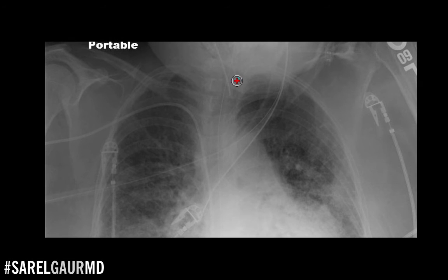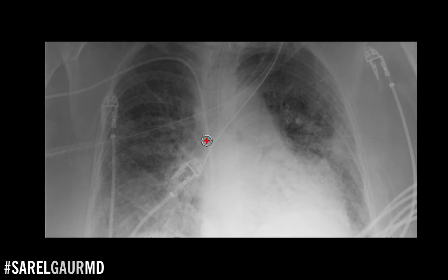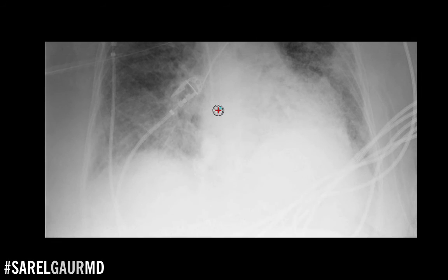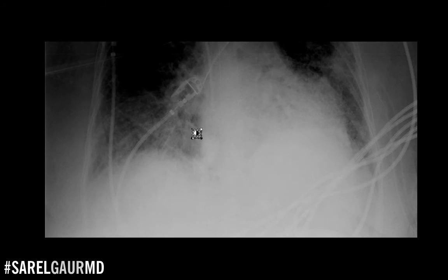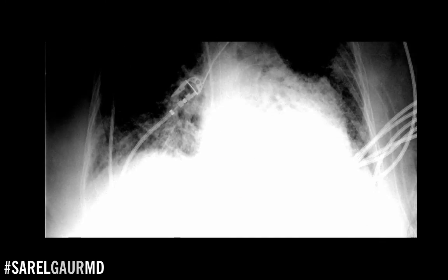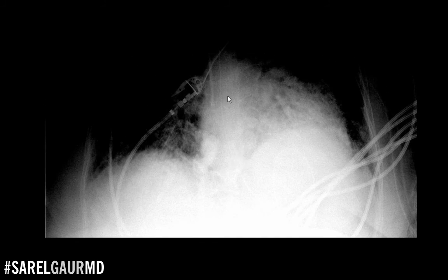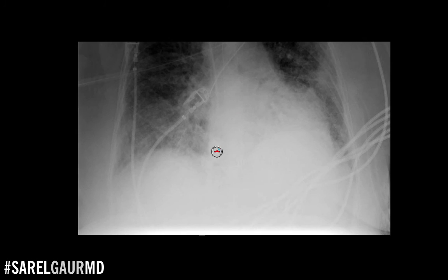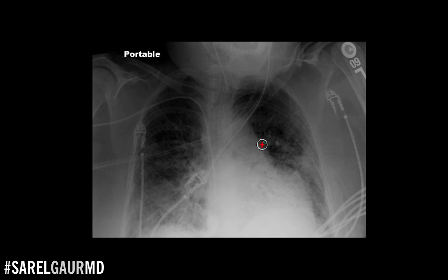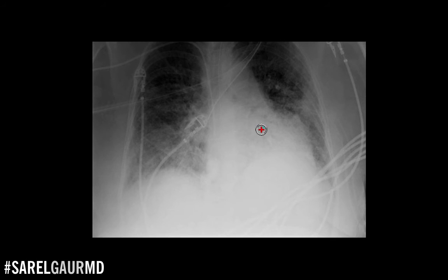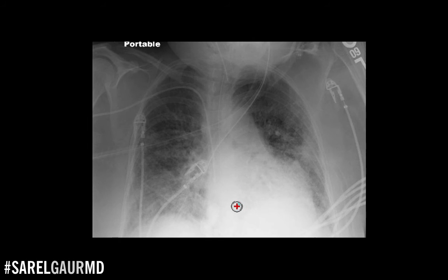Assuming I did that, looking at other lines and tubes: I'm seeing this nice PICC line here, tip in the lower SVC — good position. I'm seeing this enteric catheter coursing down in the midline, and tracking it further down, it's coiled under the left hemi-diaphragm, so definitely within the stomach and in good position. There's also some tubing that's external and telemetry wires overlying the patient. For tubes and lines, we're good.